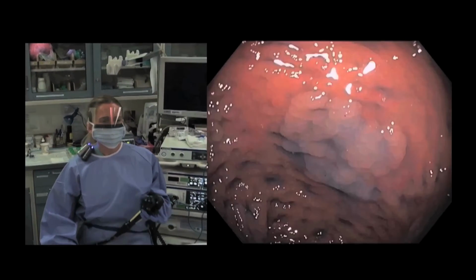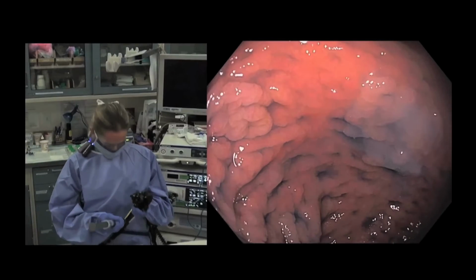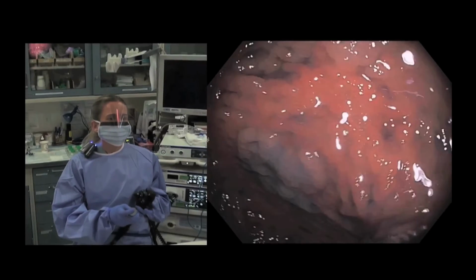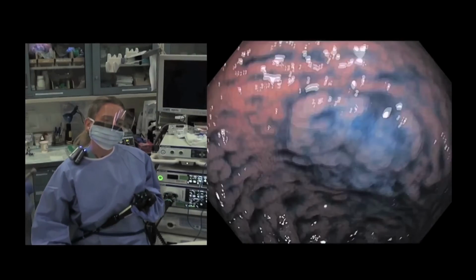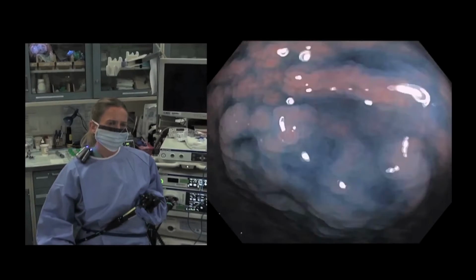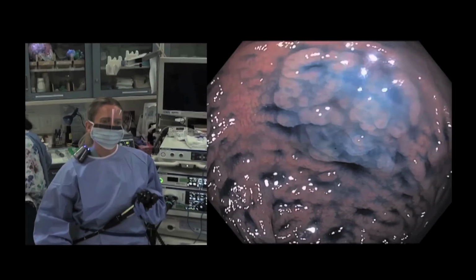With the indigo carmine spray, this area is a little better defined. And now we're going to do targeted spray. This is more concentrated, 1 ampule, 5 cc's in 20 cc's of water. You can see the borders of this area now.